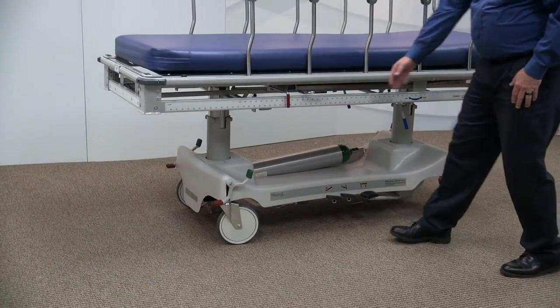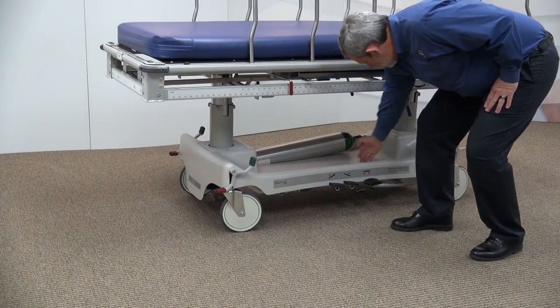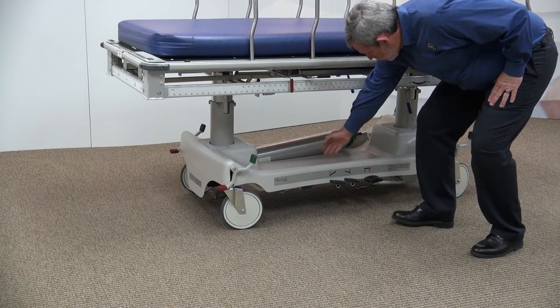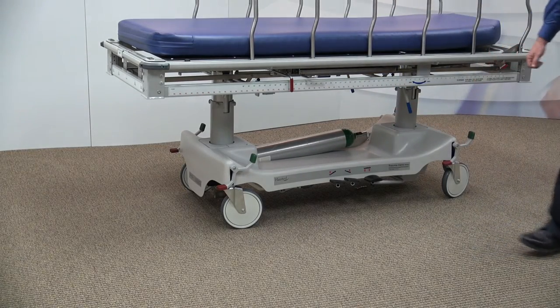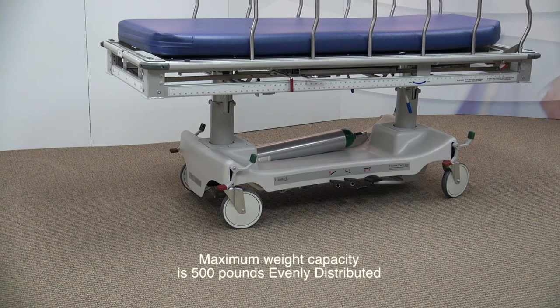Designed to be robust and functional, the base cover has a built-in cavity for a O2 tank, and additional storage space for the patient's personal items. The X-Ray Trauma Stretcher has a maximum weight capacity of 500 pounds, evenly distributed.